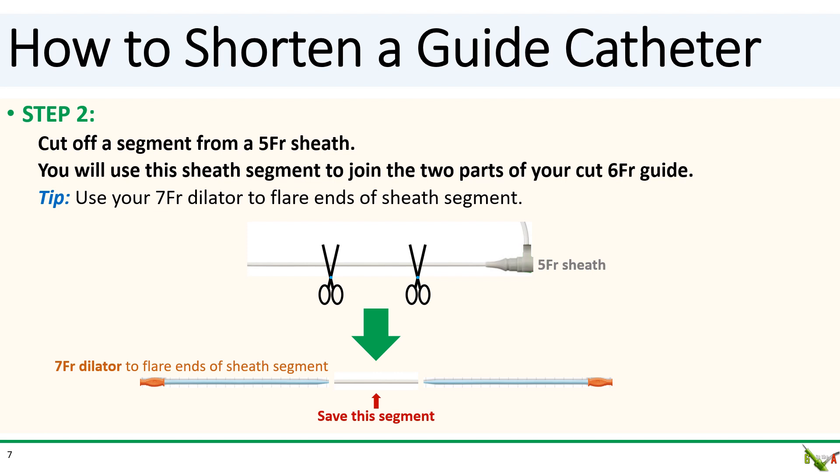In step two, cut off a segment from the five French sheath. You'll need this sheath segment to join the two parts of your cut guide. Use the seven French dilator to flare both ends of the five French sheath segment.